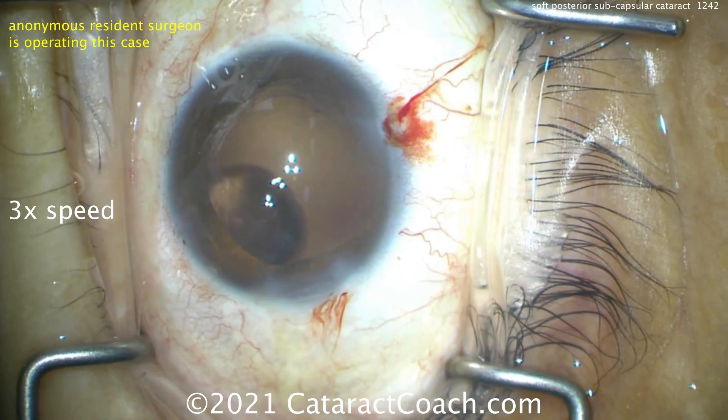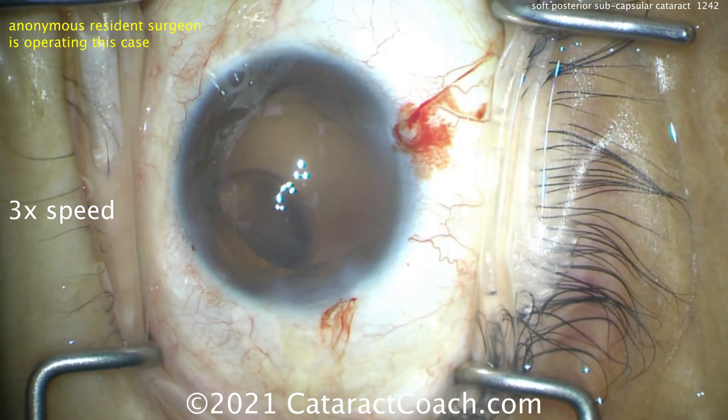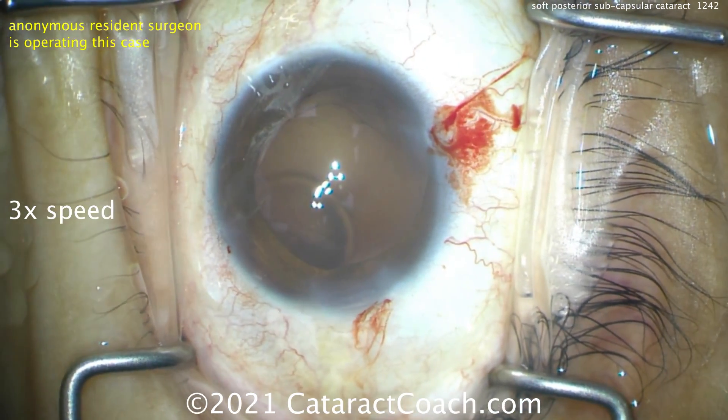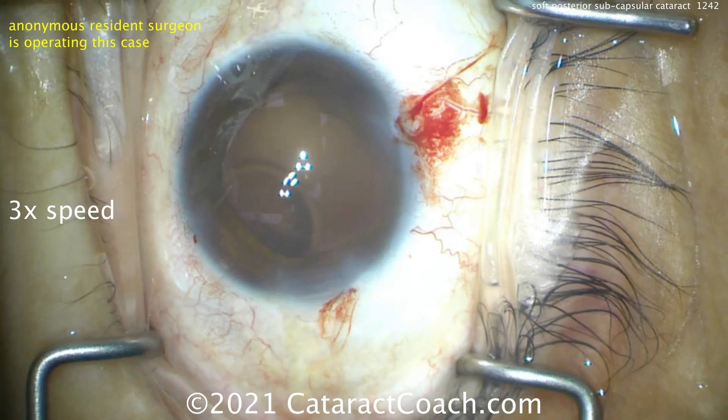Here comes a cohesive viscoelastic, getting a nice fill in the anterior chamber and more importantly deepening up that capsular bag. We're going to wait until the resident loads up the lens. It's going to be a single-piece acrylic lens — we'll place that in the capsular bag.